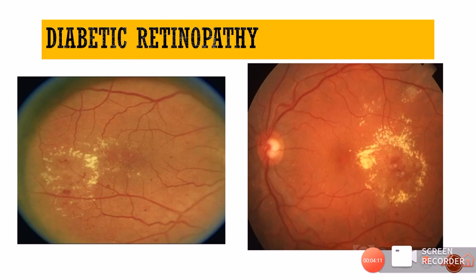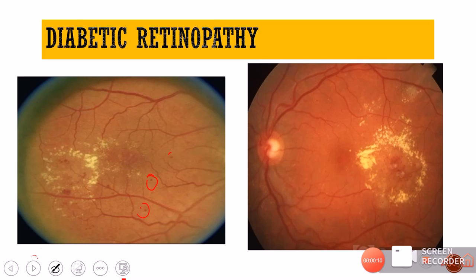In diabetic retinopathy, there will always be accompanying signs along with the hard exudates. You can see multiple microaneurysms and dot-blot hemorrhages confirming diabetic retinopathy. The hard exudates are arranged in the form of rings — this circinate pattern is visible clearly in the fundus image.